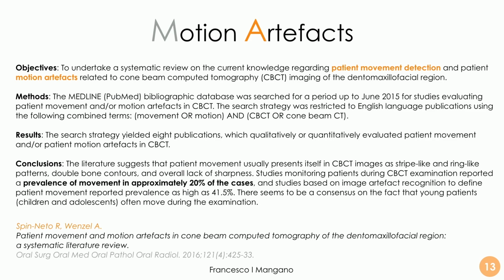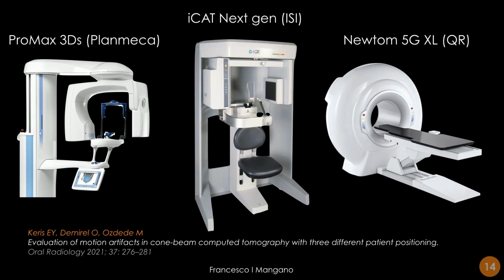And in this literature review, the authors found that particularly with young patients, so children, we can have a problem during the examination when there's the need to scan the children.